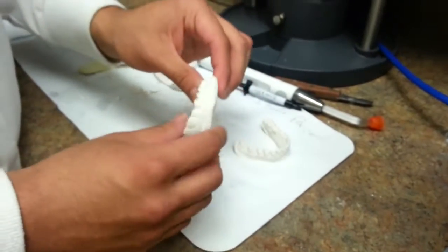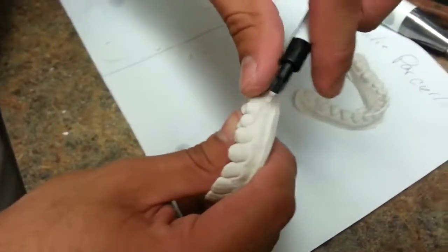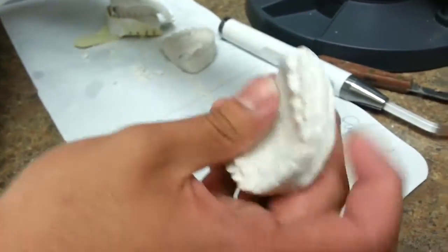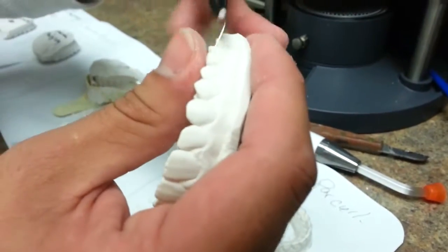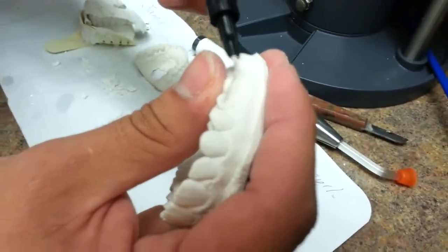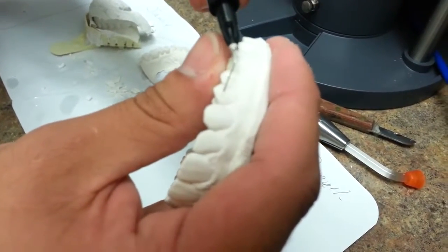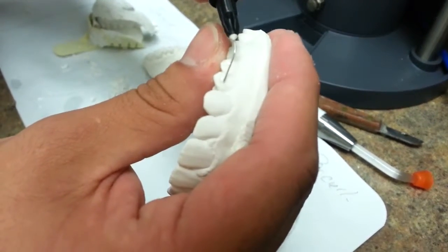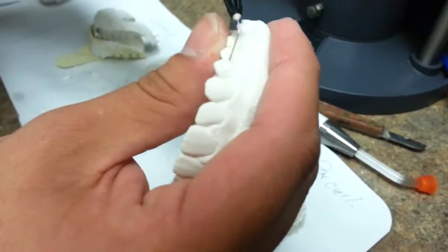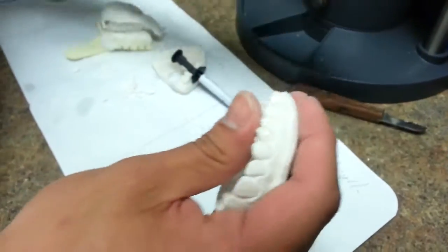And all we're gonna do, we're gonna go from the second premolar all the way to the second premolar on the other side. And we're just gonna put a light coat on top of the tooth. That looks like a bubble type of thing. The reason we do this is because that way, whenever we're making the trays, the whitening material is gonna stay in here.